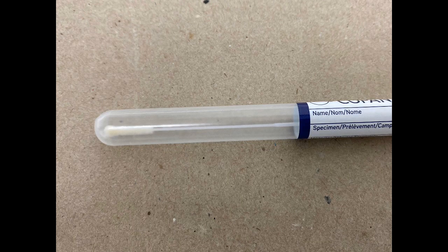If you have a look at this swab now, this is what the corona swab looks like. It's a long, flexible swab with a slightly fluffy end. For demonstration purposes, I'm going to be using a very similar swab — long and flexible with a cotton end that's a little bit fluffy.